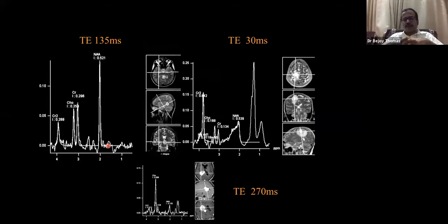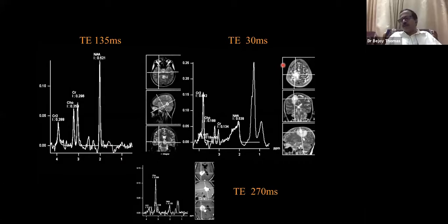For example, in a metabolic disorder where you are looking at minor metabolites, you will be interested in a TE of 30 or 35 millisecond, low TE spectroscopy. Usually now we can do point resolved spectroscopy, both low TE as well as intermediate and high TE.